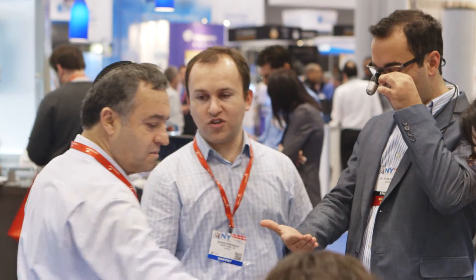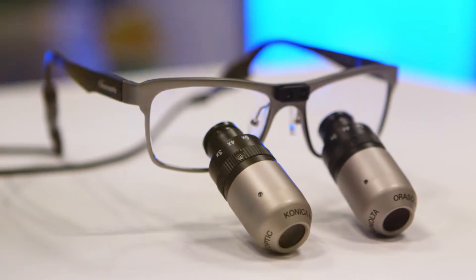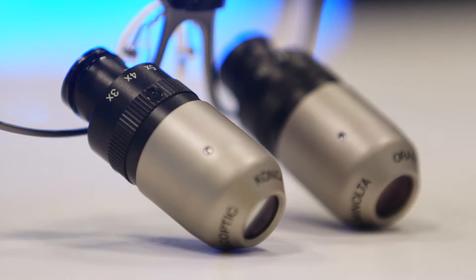We're here at the Greater New York Dental Meeting to see what real people think about the Oroscopic Eye Zoom — the first and only multiple zoom dental loupe.